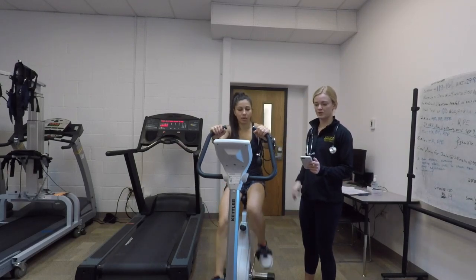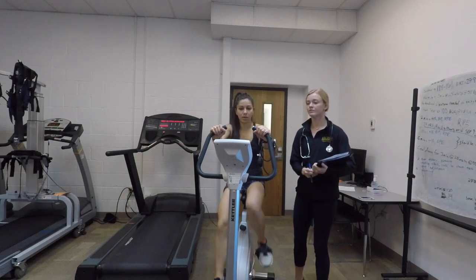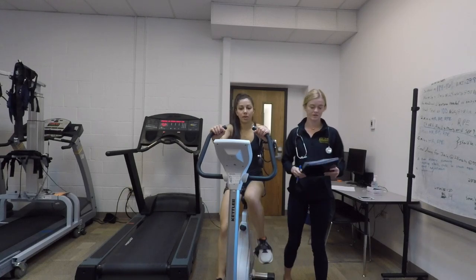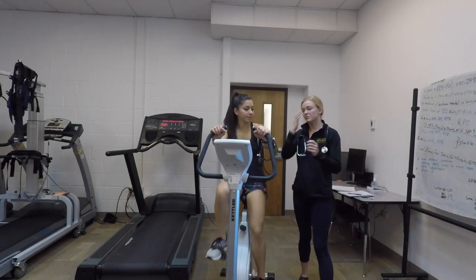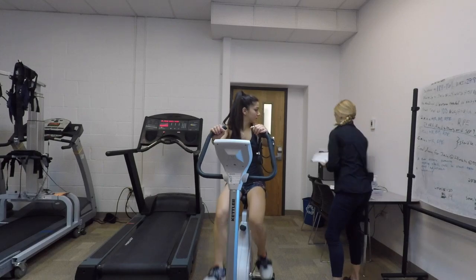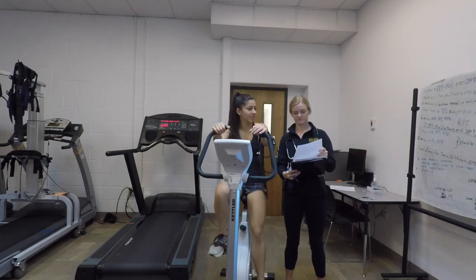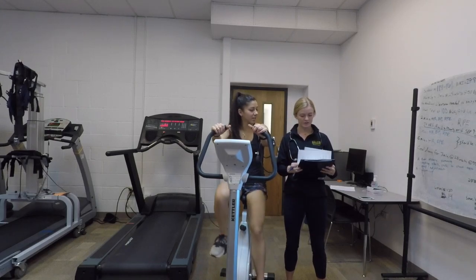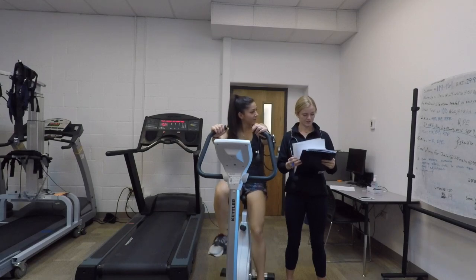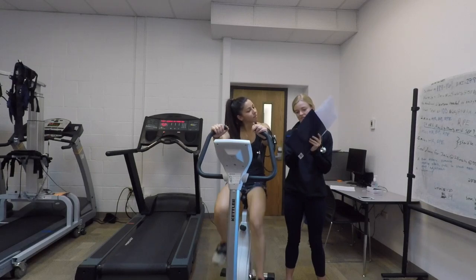We're almost at the 2-minute mark. Okay, so it's been about 2 minutes. I'm going to go ahead and take your heart rate, but actually before we do that, I have the Borg scale right here. What is your rate of perceived exertion? 11, okay. Oh, actually, hang on. Yeah, 7. 7? Oh, okay. Just kidding. So, 7.